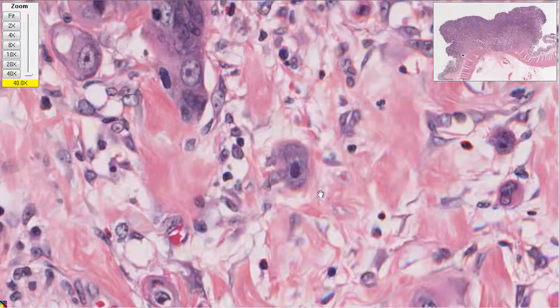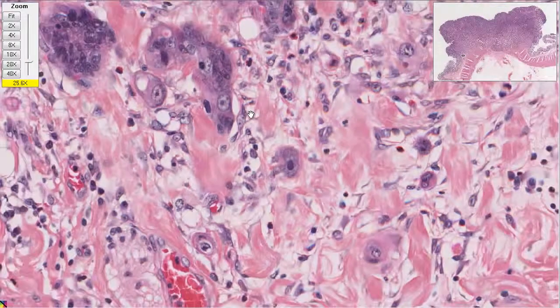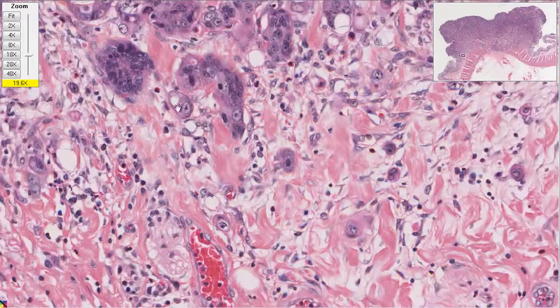If you can get a cell where the nucleus gets that big, sometimes it's that big, there's chaos. And there's chaos not just in nuclear size, but how it behaves. I guess the nuclear size is a telltale, because that means that the cell is devoting a lot of its resources to replication. It's replication, but it also means to me that normally things in the cell are very orderly. You do not divide your DNA until these things are all right. And now the cell is just doing it left, right, left, right. So yeah, this would be a high-grade tumor.